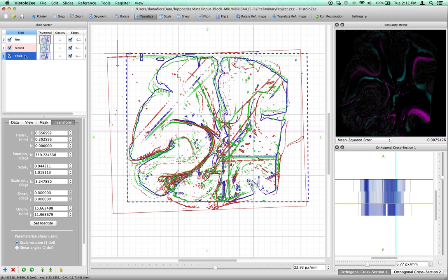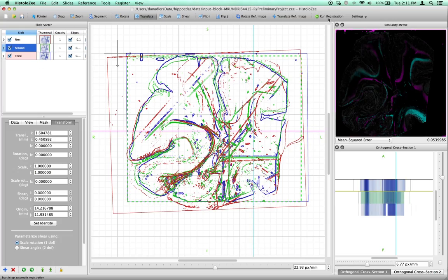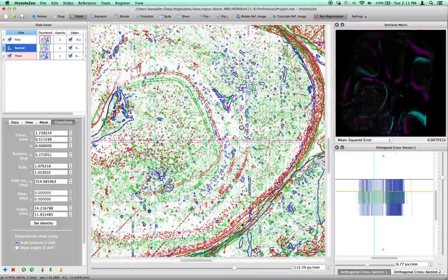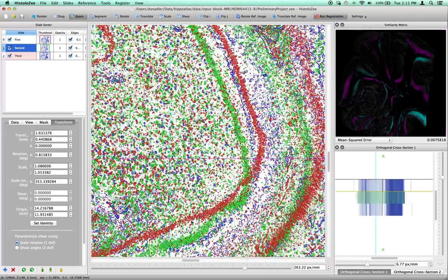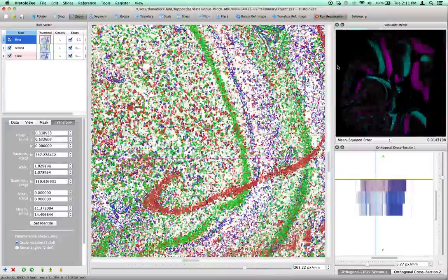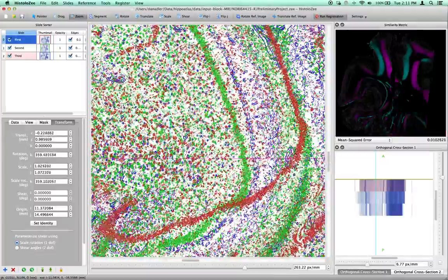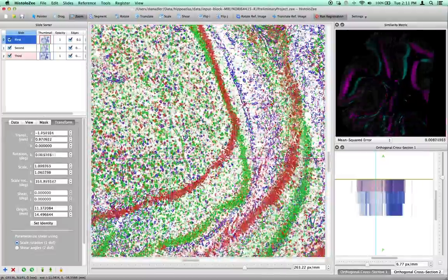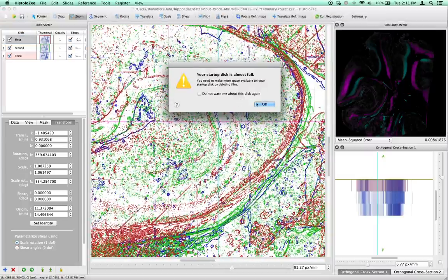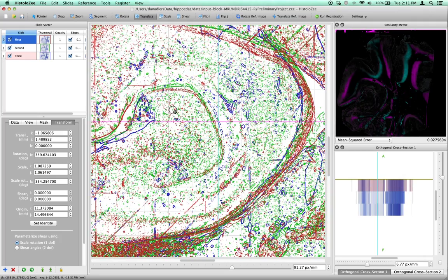Not bad. We can change the slide that is currently selected as fixed to the third one, for example, and run registration to that slide. And you can, of course, zoom in and see things register on the fly at any level to see if the features that you want are being aligned. And now we'll register the first slide to the third slide. So this just shows one of the drawbacks of automated registration. We don't have full control over which features become aligned, which is why it's very handy to have this interactive registration tool, which lets us fix things up. Okay.